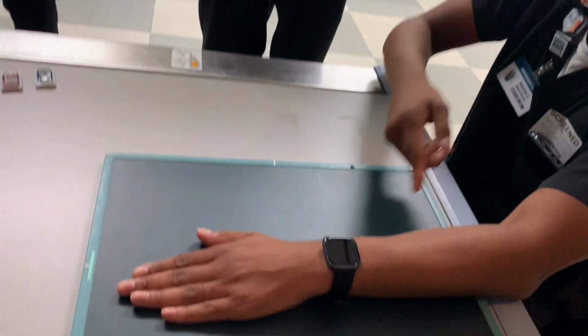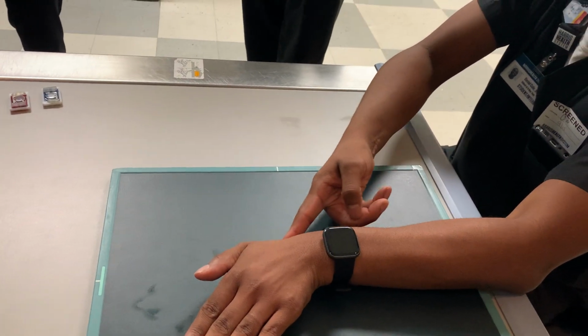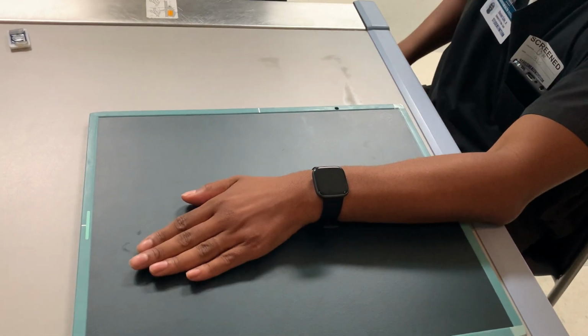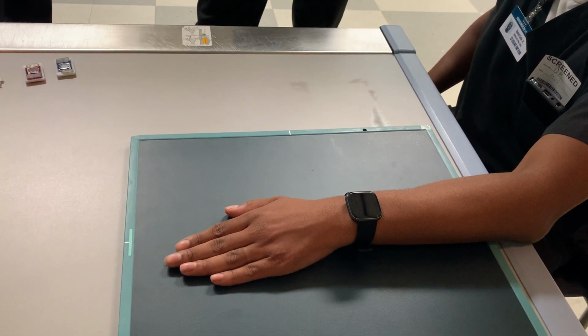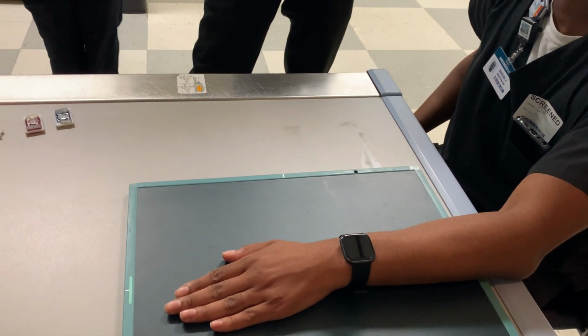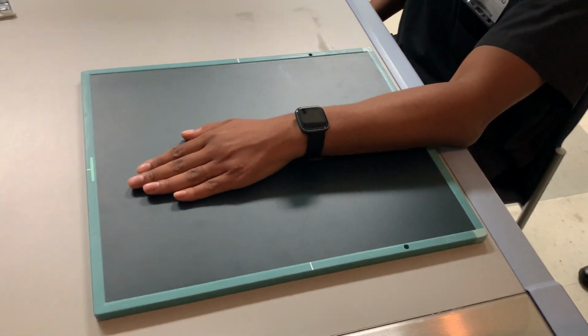Go ahead and feel for that. Do you feel that bump right there? You're coming up the arm, and there's a bump right there. That is your radial styloid process. From that bump, you can go 3/4 of an inch medial and 3/4 of an inch distal to find the scaphoid.